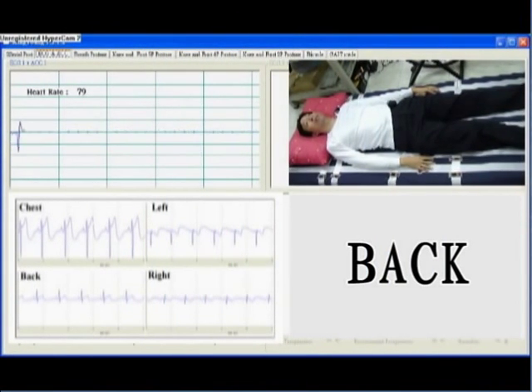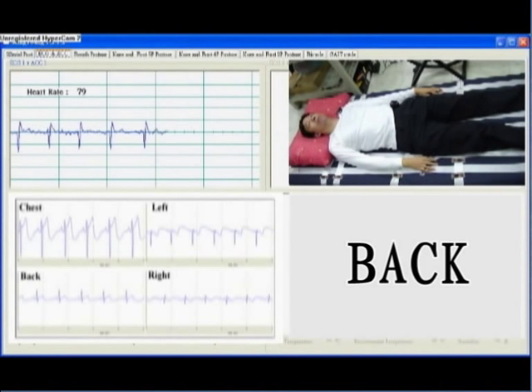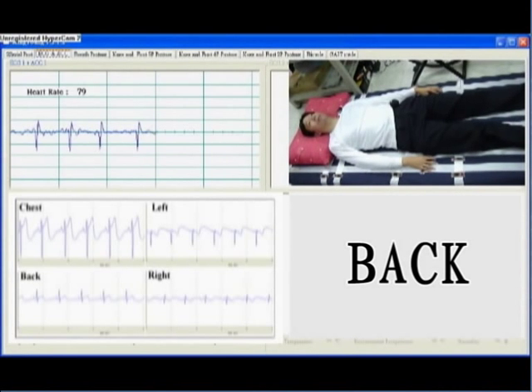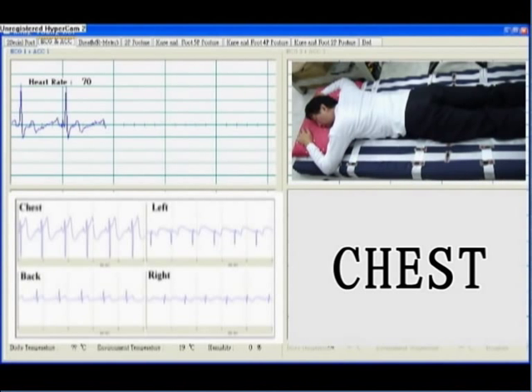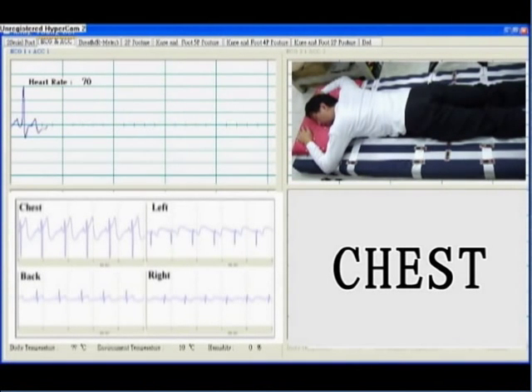From the ECG electrodes on the shirt, we can easily take the sleeping ECG signal. Please note his cardiac arrhythmia.